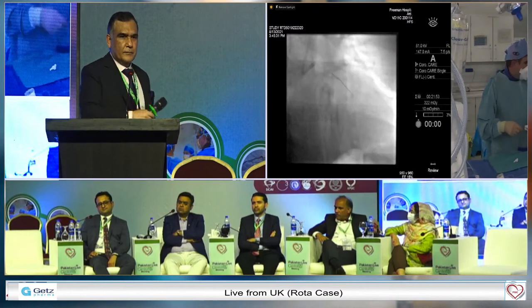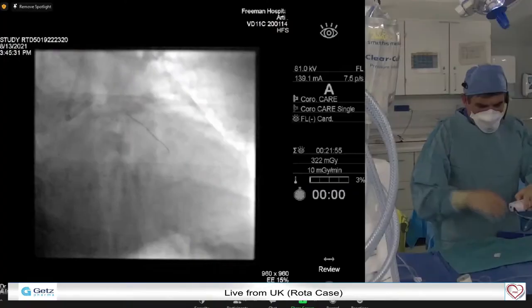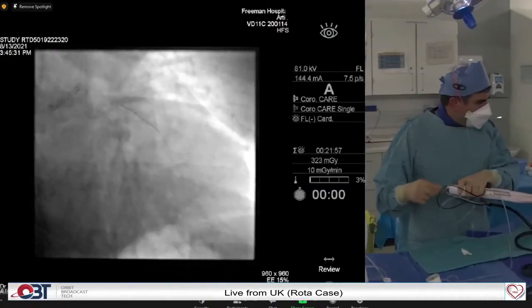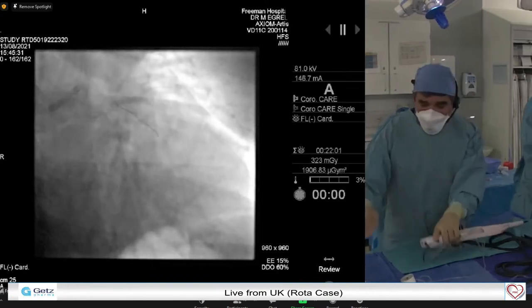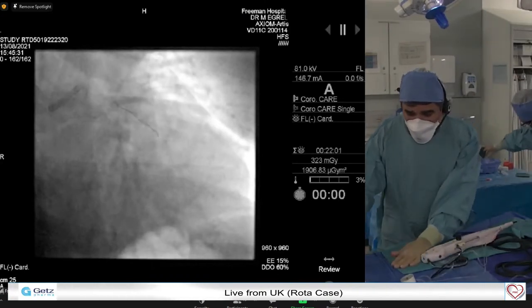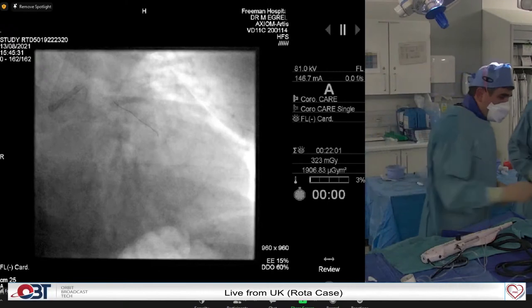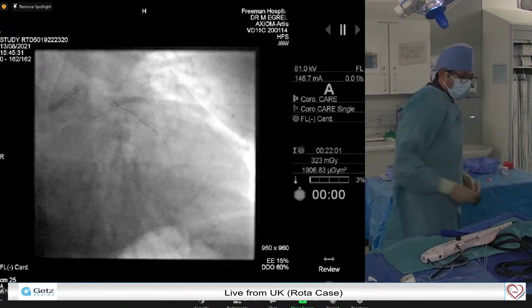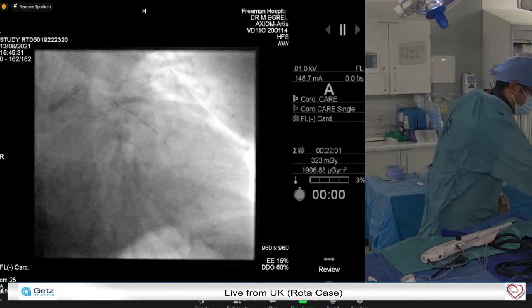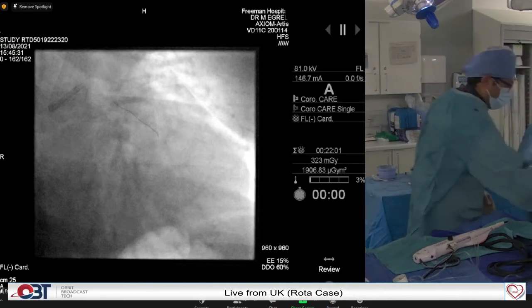I don't know if I'd call it the proper way, because as long as it works, I've never had any problem. And I do probably close to 60 or 70. Yes, but I'm talking about fellows. I'm not talking about you. For sure, you can do whatever you want. I'm saying it's the teaching. No, you could teach them. I think it is the old way of teaching them, and that's gone out of the window. It's not valid anymore. You could DynaGlide forward.